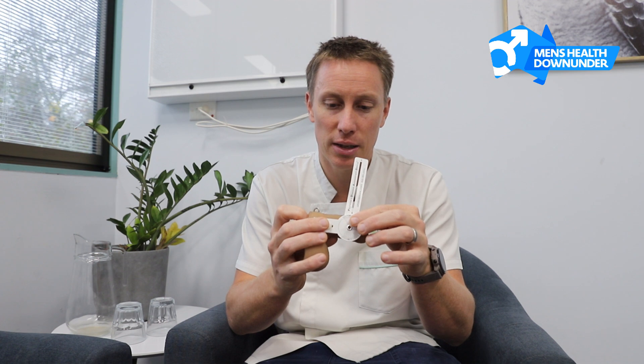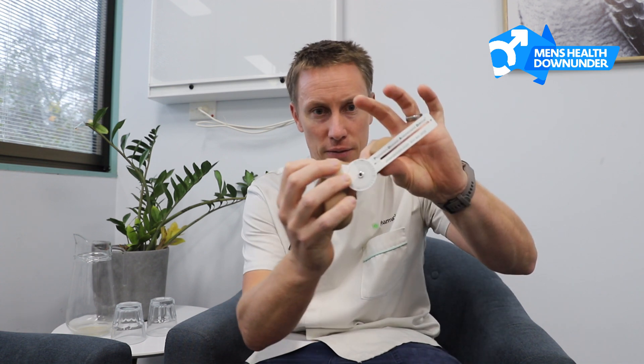The PDAD is a very simple piece of equipment, but the beauty of it is that it allows you to quantitatively measure the bend in the penis. It goes against the side of the penis, the hinge goes where the bend is, and then very simply, you measure with the protractor the curvature in the penis, and that gives you the number.